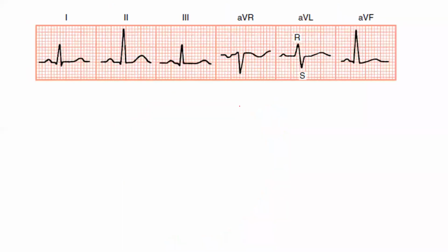Okay, then third, this one, homework, like now only, who will do? And if possible, tell me the correct degree also, where it comes. Somebody, which degree does it come to? We know 0 degree, 60 degree, 90 degree. Between 2 and AVF, okay. 60 normal, normal 2, okay.